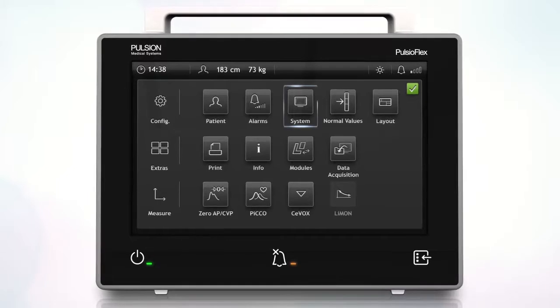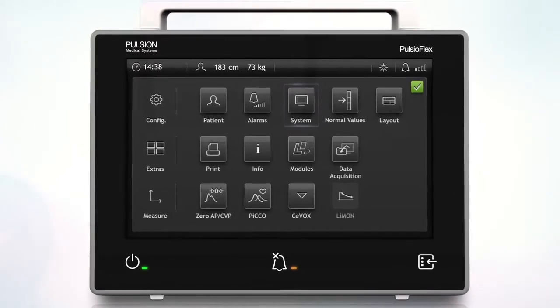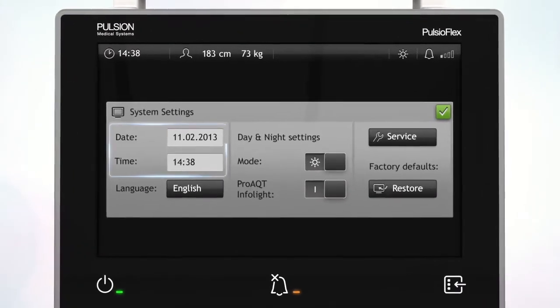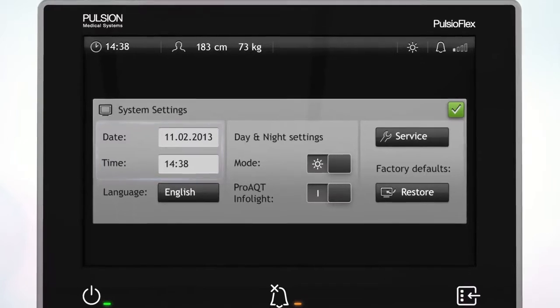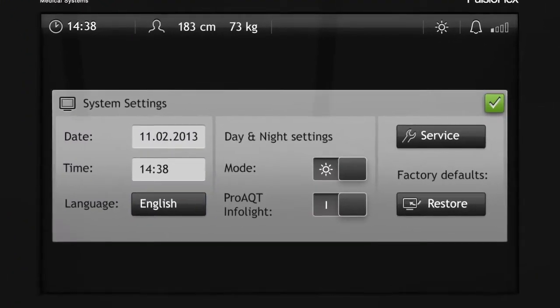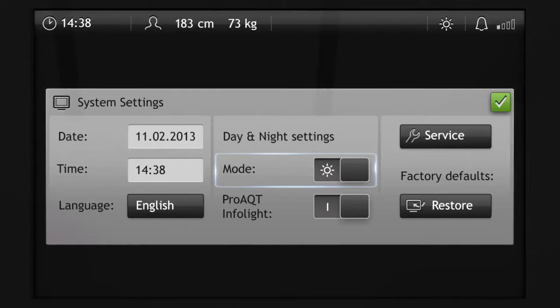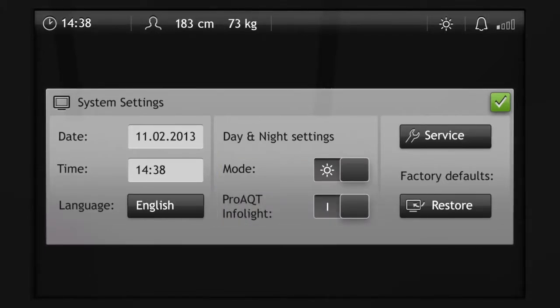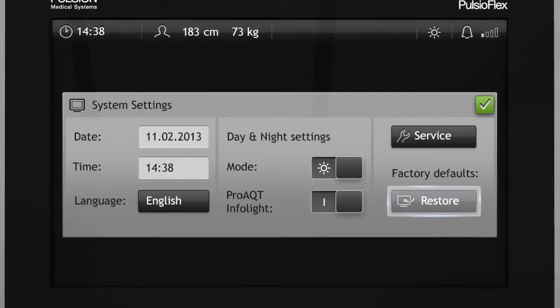In the system settings menu, you can change the date and time setting, the software language setting, the background light mode switch, the mode switch for the PROACT InfoLight, entry to the service screen, and the Restore button to reset the factory default.